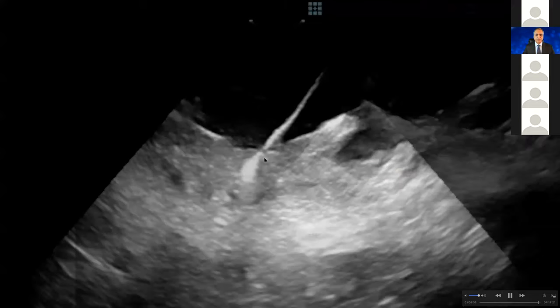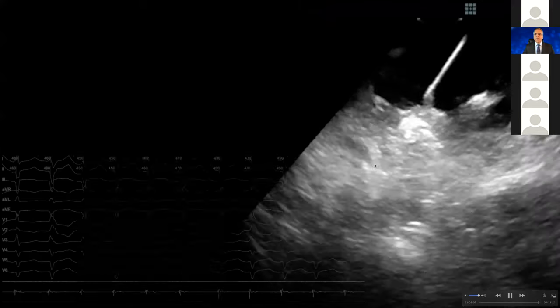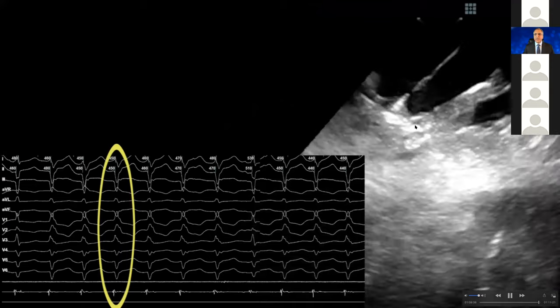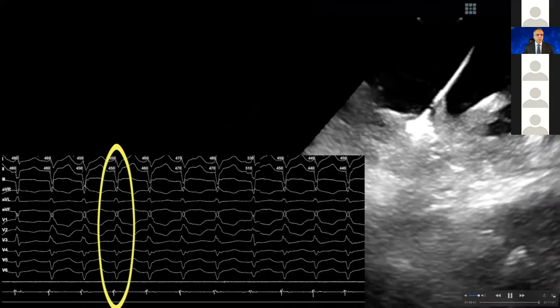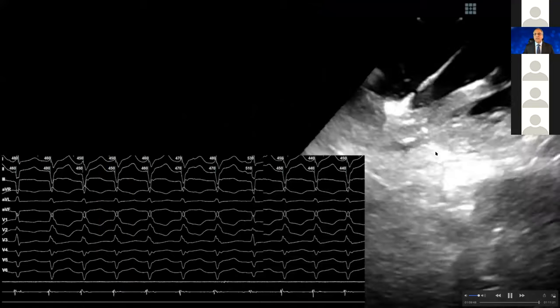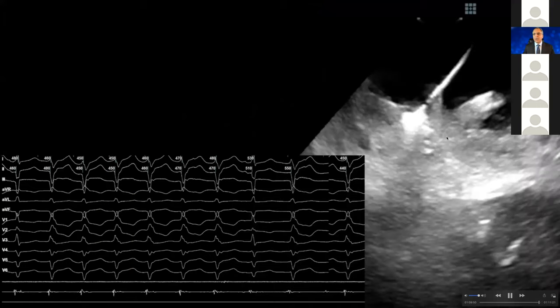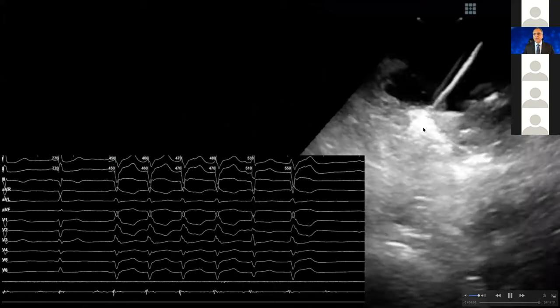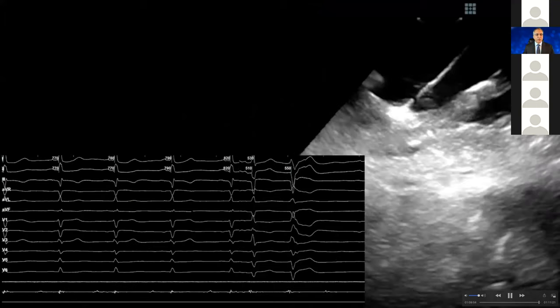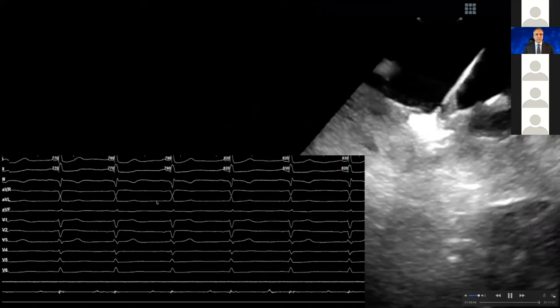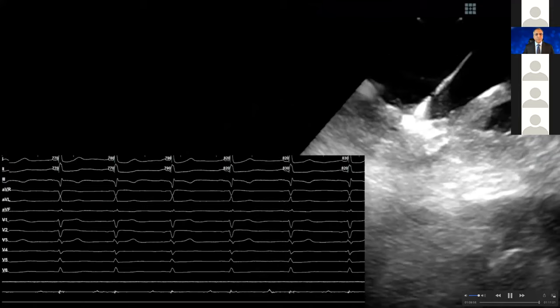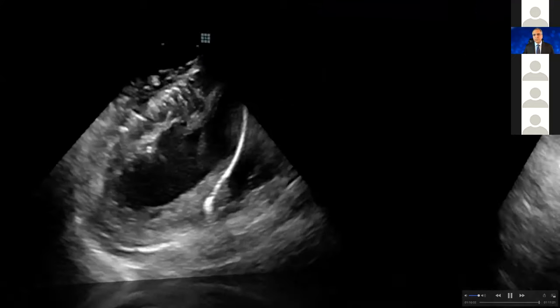Here as I'm burning — this is the posterior medial papillary muscle. This time you see V1, V2, V3 are positive with a right bundle morphology, but they are negative in leads 2, 3, AVF, so you know it is the posterior medial papillary muscle. As I'm burning you can see the lesion formation, and subsequently you can see the elimination of the PVC right there.